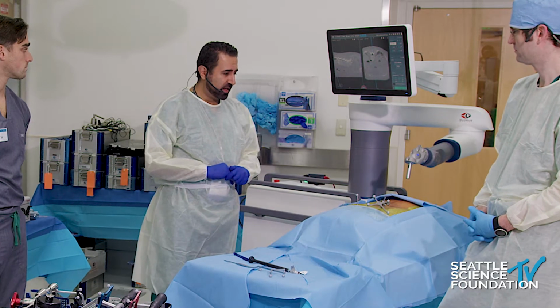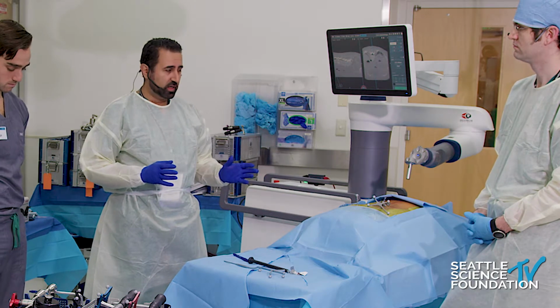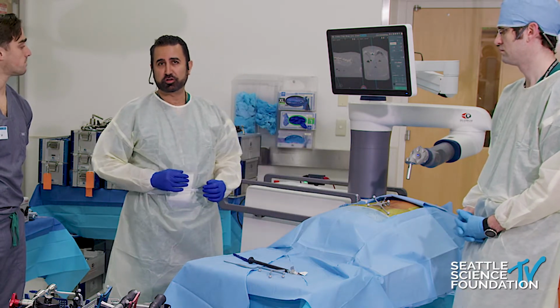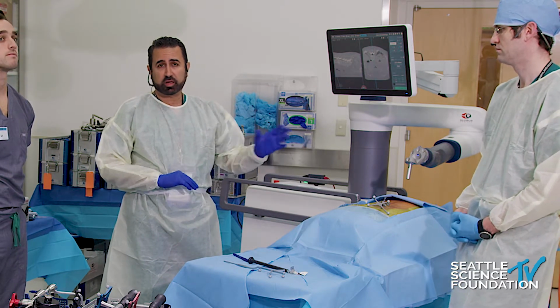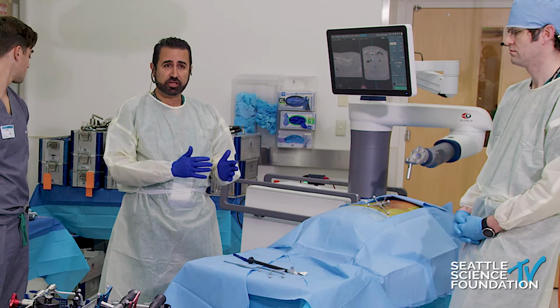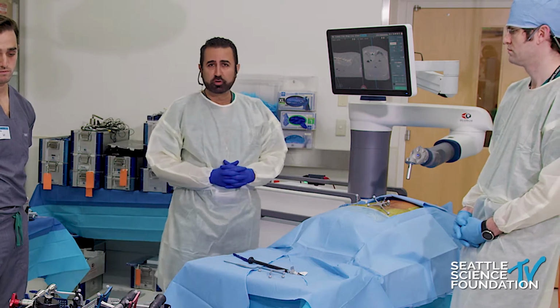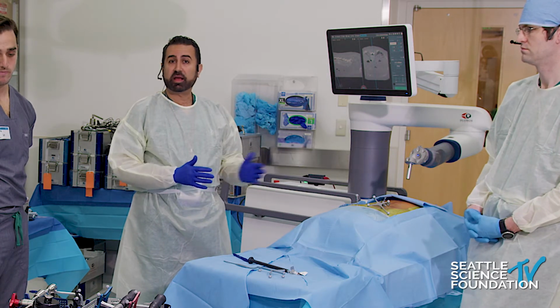And finally, I want to emphasize, and we'll do that in the talk, what it isn't yet. It is not an automated machine that does the drilling for you and puts the instrumentation in for you. So you still need to be a surgeon, and the capacity that you have here with respect to judgment, particularly when it comes to skiving, placement, preoperative planning, allocation of instrumentation so that it makes your life easier, for example, with rod placement and so on. All of that is still needed. So technology improves, but at this point, we still need our own intrinsic understanding to make that technology work.